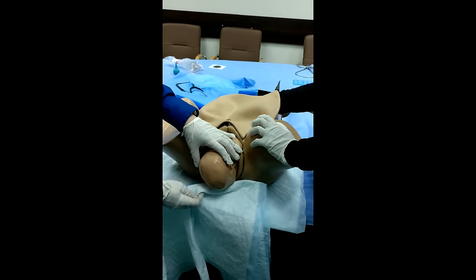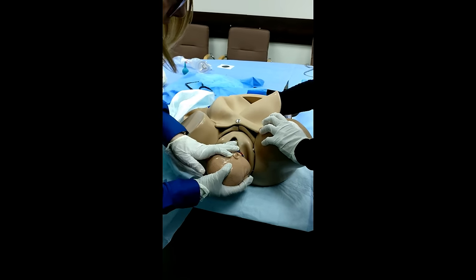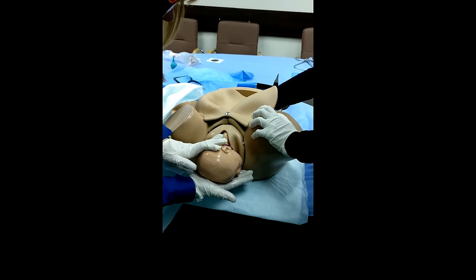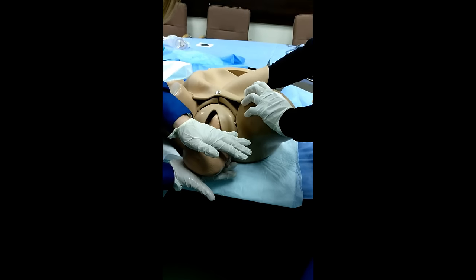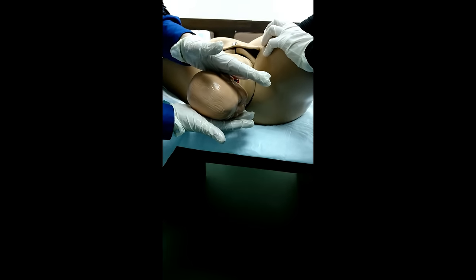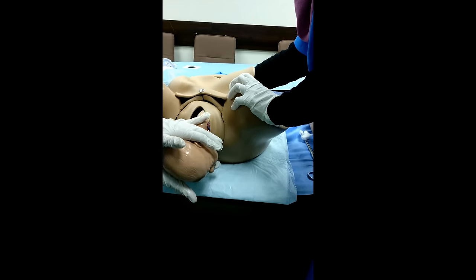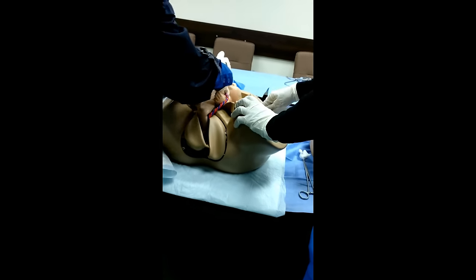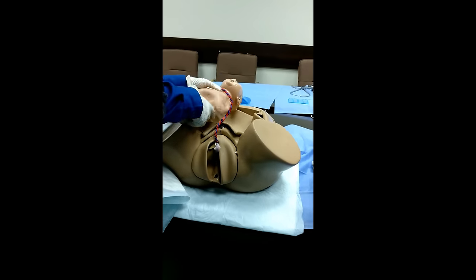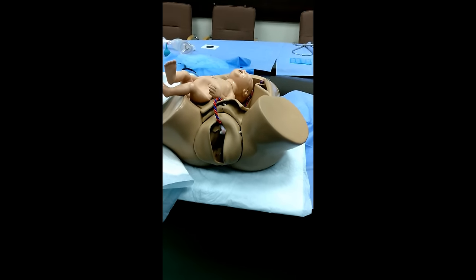After that, the mechanism of labor will be external rotation of the head and internal rotation of the shoulder. We just hold the head of the fetus with a gentle axial traction till the delivery of the anterior shoulder. After that is delivery of the posterior shoulder, and the fetus is put on the abdomen of the mother. Clear?